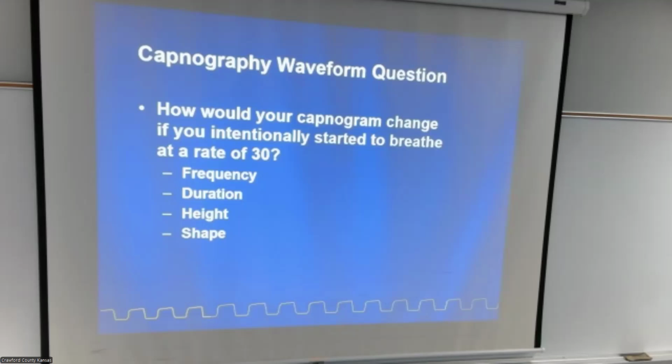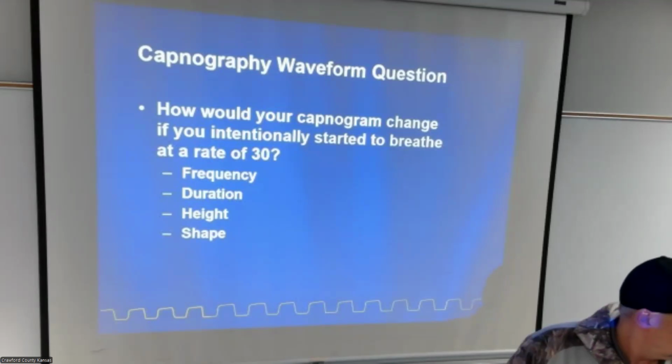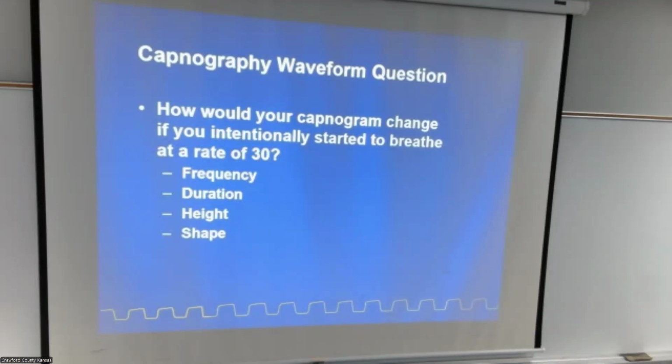My best advice would be to assess your patient and treat accordingly. And don't just use one reading. Use your pulse ox, your CO2, your patient's blood pressure, your everything. A full assessment. Assessment's the biggest thing, the best thing we can ever give our patient is a good assessment.